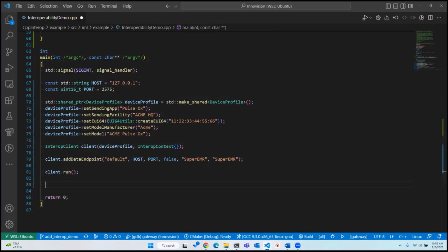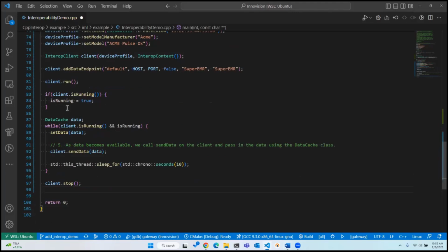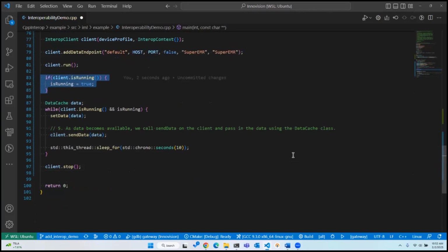Because I'm running this demo in the console, I've got some code which is going to help me start and stop the demo. I'm just going to paste that in. That's not really what this is about. Okay, so I'll just go over what I've got here. Here I'm checking if the client is running, and then I'm setting that flag up above to true to show that we are indeed running. And while the client is running and we haven't received any input from the user to stop, I'm going to set the data and send the data using our interoperability client. I'm going to do that every 10 seconds until I'm told to stop. And at the very end, we'll call stop to clean up.